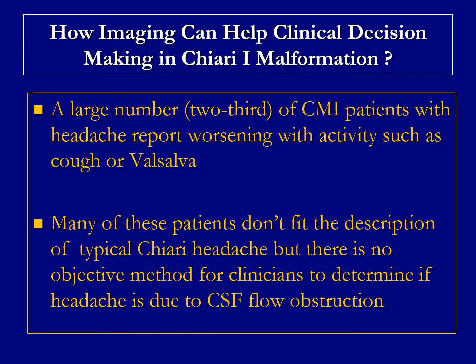How can imaging help in clinical decision-making in Chiari malformation? We know that a large number of patients with Chiari headache report worsening with activities such as cough or Valsalva. However, many of these patients don't fit the description of typical Chiari headache, and there is no objective method, one that clinicians can rely on, not dependent on the patient presentation or clinical history, to determine if the headache is due to CSF flow obstruction.